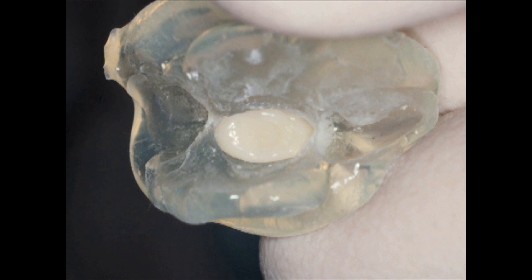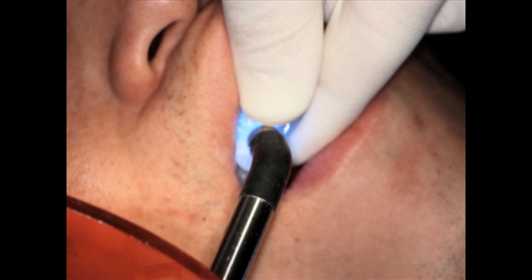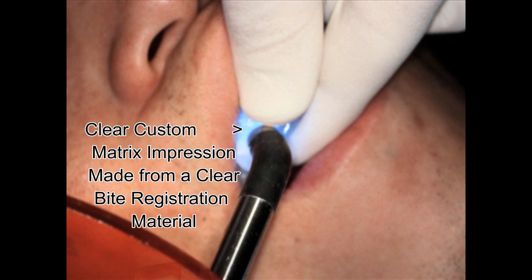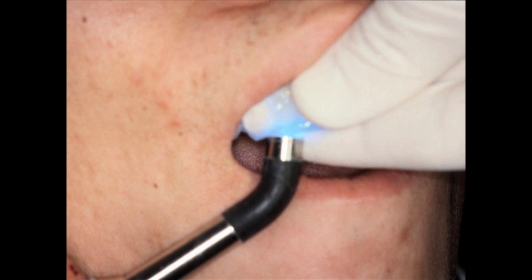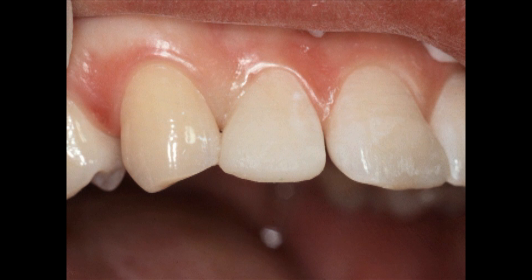I fill the matrix with composite of the correct shade, using my model to see how much wax I used and where the wax was, and I contour the composite to match that wax. We roughen the surface of the tooth slightly, acid etch that surface, then place this back into the patient's mouth and cure it from the labial, incisal, and lingual surfaces. Even if it's a younger child who won't sit still, I can create unbelievable surface contours while the child moves because everything is held as a unit by the other teeth. This is immediately after curing — notice there is some flash, but it is supragingival.